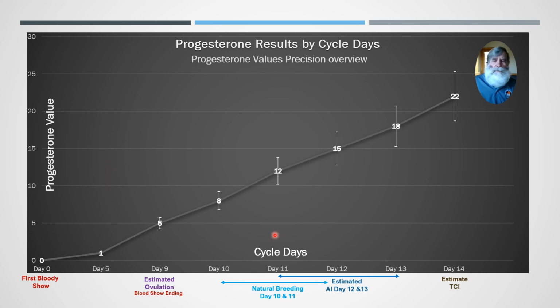And again, as a summary, we're talking about the chart of your instrument, based off a range of numbers. There's no such thing as just getting a 12, 15, 18, 22. There's always a range involved, and that's determined by how precise your process and your instrument are. We're going to go through that in a second.